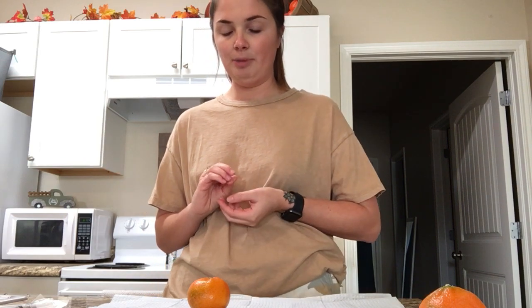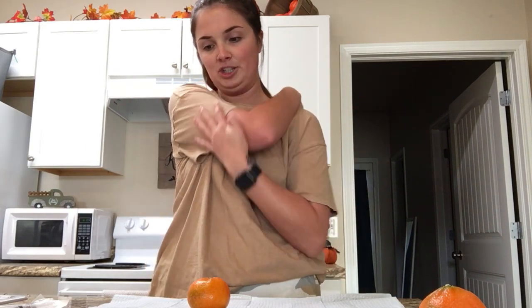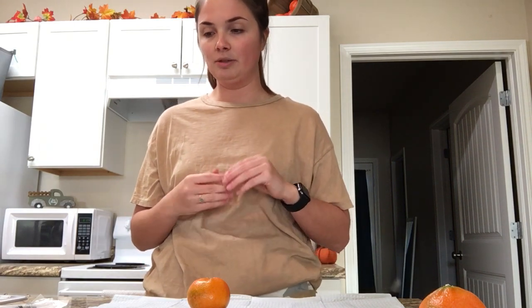So I'm going to do my rights of medication. Right med, right dose, right patient, right route, right time, and right documentation. So we're gonna do our rights of medication administration. And then while I'm in the patient's room, whatever.